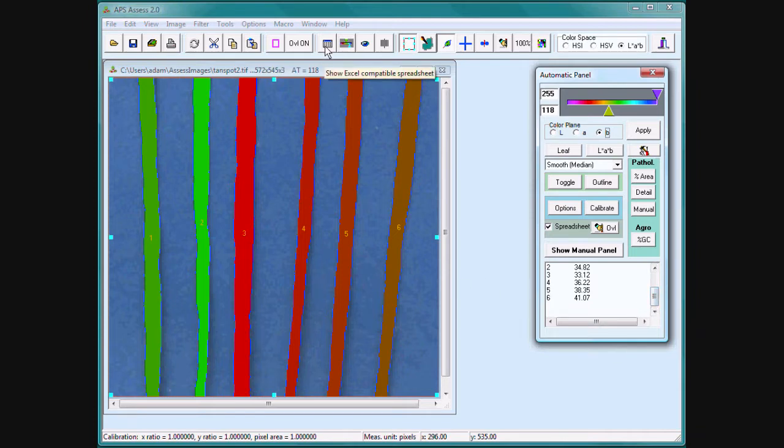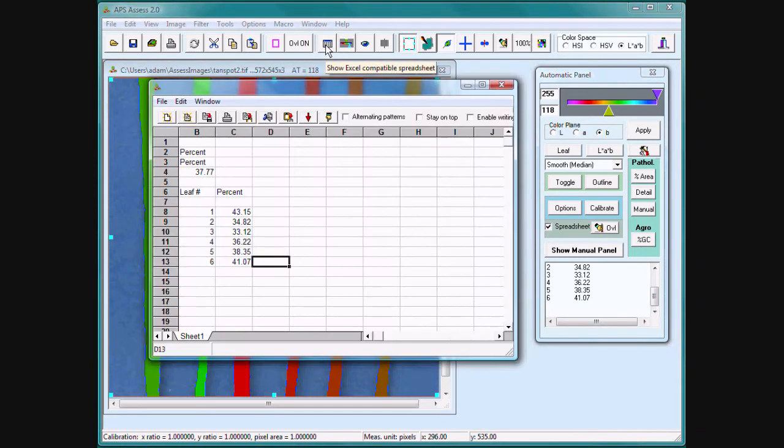As always, if the spreadsheet function is enabled, the data is copied directly to the spreadsheet.